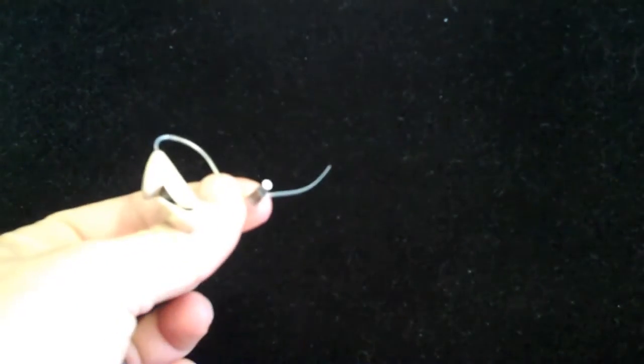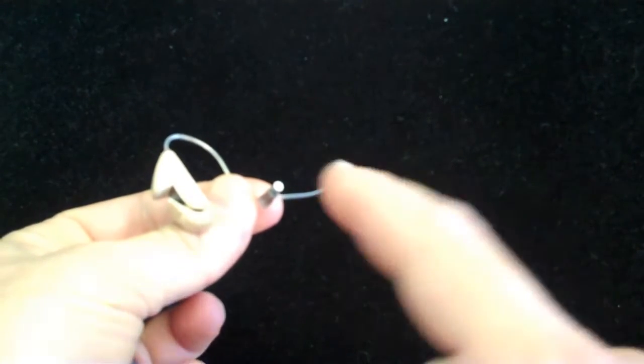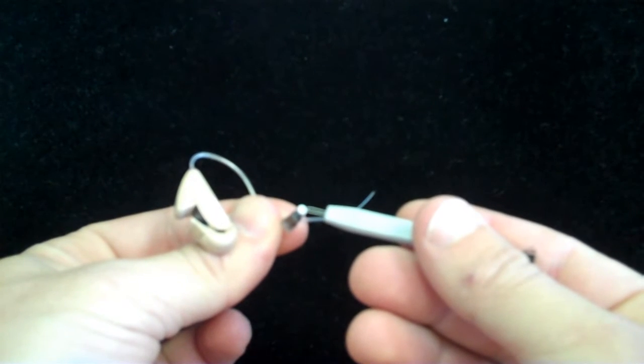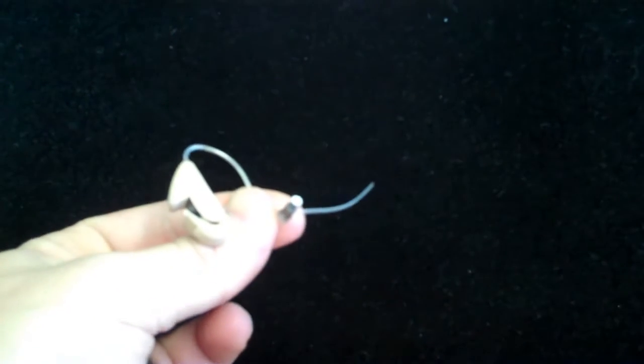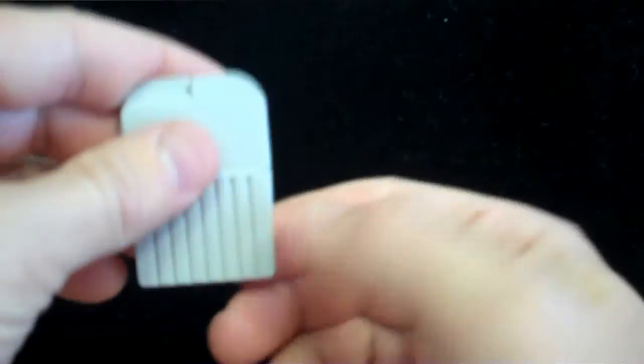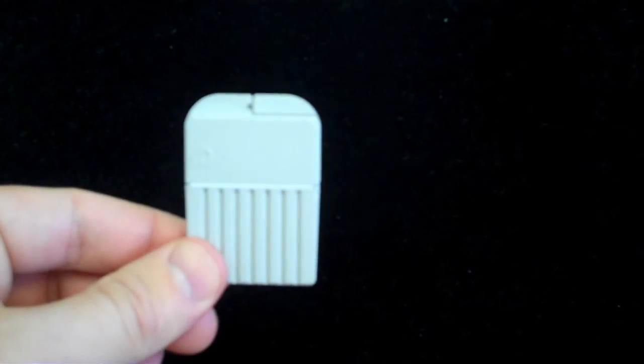Now secondly, at the end of the receiver, I'm not sure if you can see this on camera, but you have a very small white basket on the end here. This is the wax trap in question. This particular type of wax trap comes in a case like such.